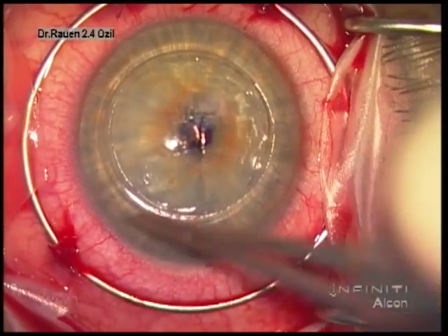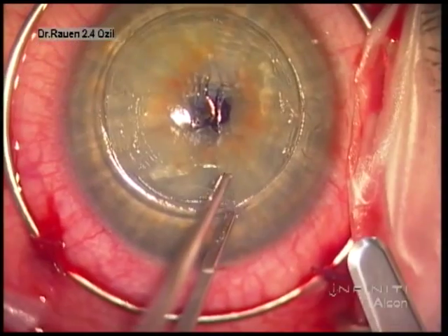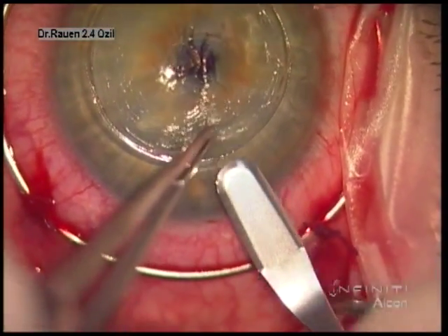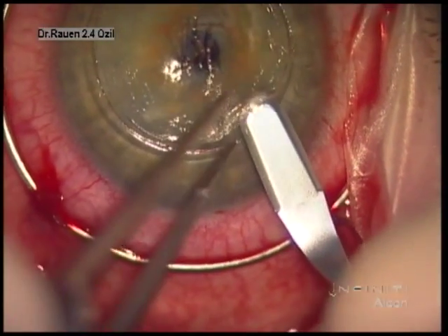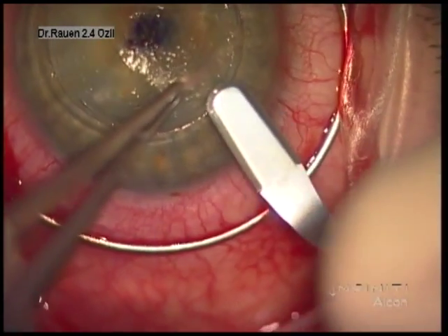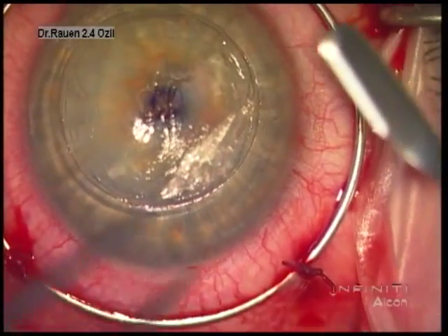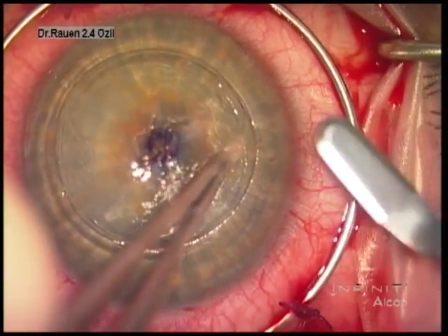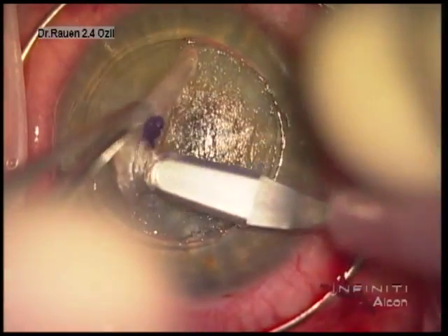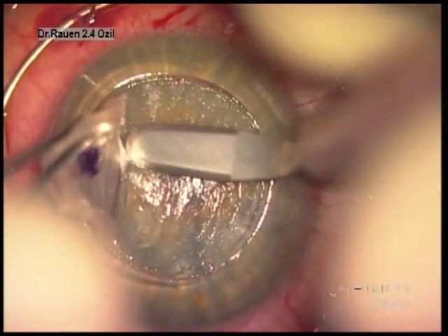You can see us just inspecting the groove at this point. I will sometimes remove the anterior cap if the corneal thickness is at least 350 microns throughout its extent. If it's much thinner than this, we'll just leave the cap in place prior to performing the air dissection. We're using a crescent blade to facilitate this.